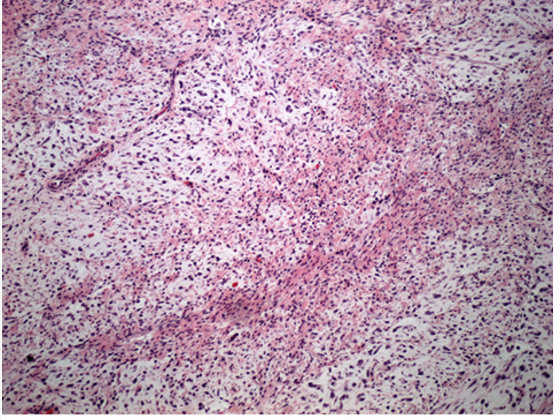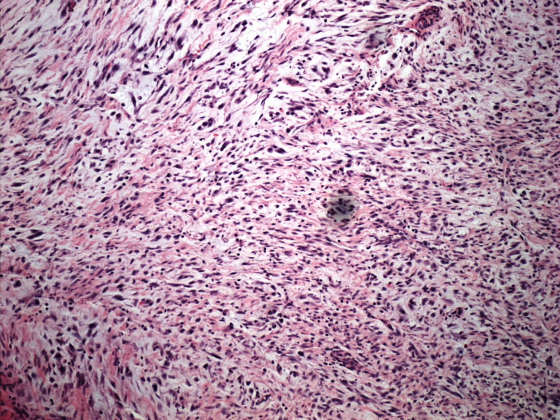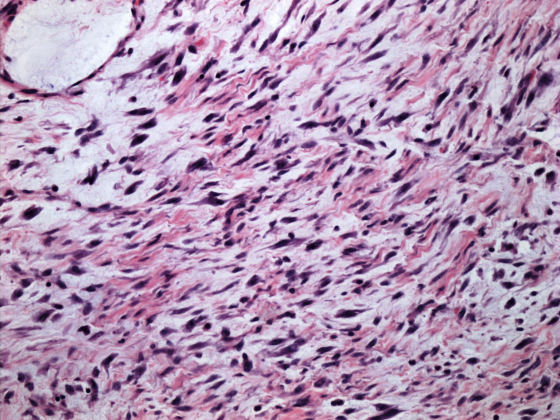So this is a low power version. The resolution isn't so great, but you can get an idea that there's also that spacing out of the cells, that hydropic looking change. And on a higher power, you can see the nuclear atypia, I would say, is mild to moderate. The mitotic activity, I'm not seeing a lot of mitotic activity here, but I do get an inclination that there might be inflammatory cells, which we can see at a higher power.